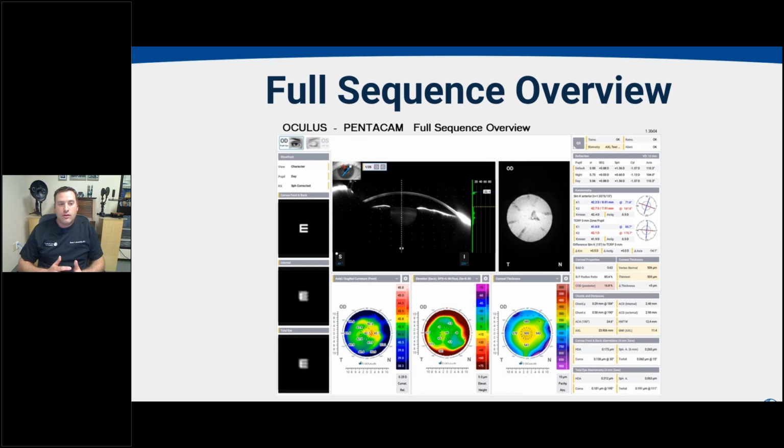So for example, if you're looking for aberrations and where the aberrations are coming from, there's a nice simulation to the left where you can see the top is the corneal front and back aberrations. The middle is the internal aberrations, with the bottom left being the total eye aberrations. And it gives you a really nice simulation of where the visual disturbance is coming from. And you can pull your view all the way over to the bottom right and get a full measurement of those aberrations to help you decide whether this patient is a good multifocal candidate, where normally you might have to look through multiple devices, multiple pages to make that decision. Sometimes you even have to come back to the room and tell the patients separately if you have to look some extra things up. This gives you a really nice snapshot about the patient's eye and what might be the best IOL of choice.